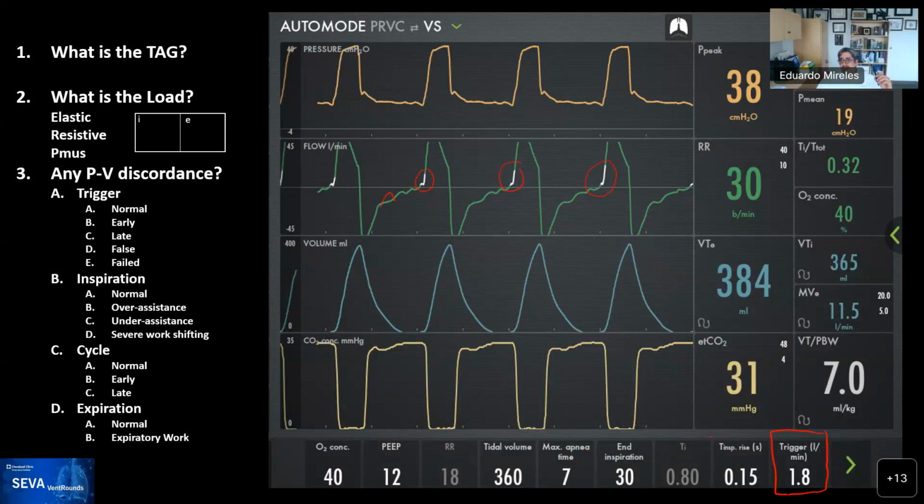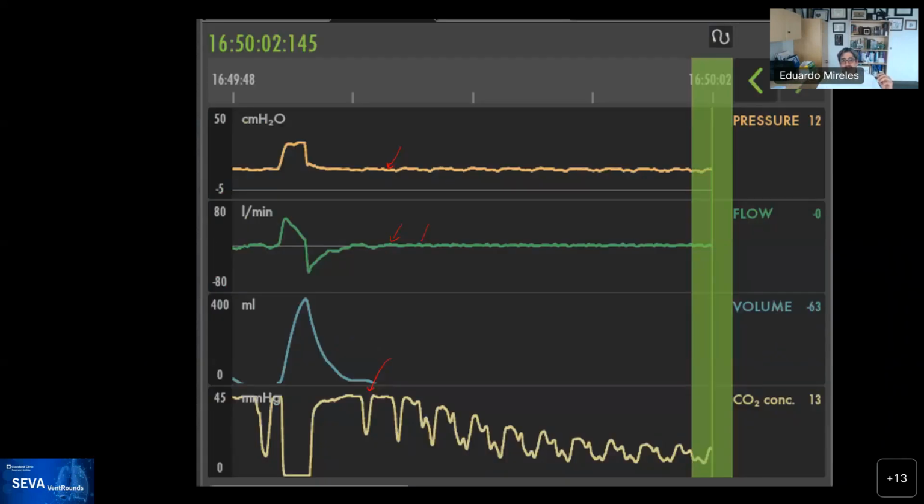So this has implications in general for patient care. You can imagine somebody evaluating for brain death who says, well, there's respiratory effort on the ventilator, rather than doing a pause and looking to see if there really is effort or not. When you do the pause, you can see what looks like effort, but you don't see any effort over here.